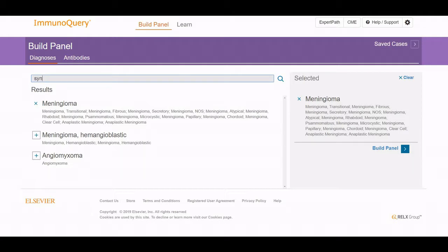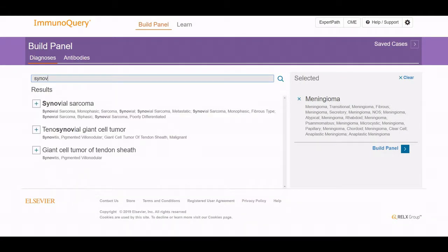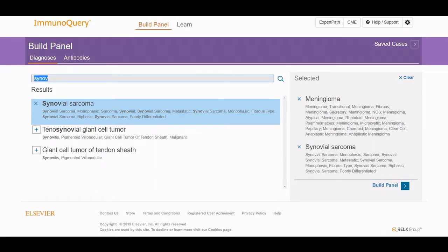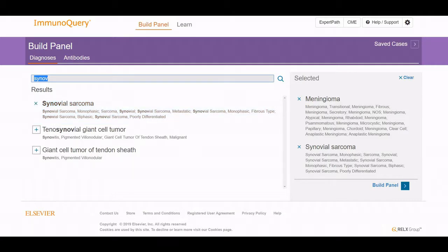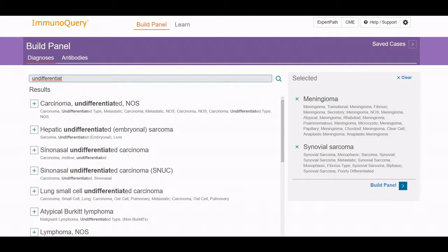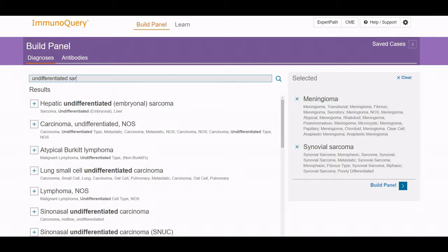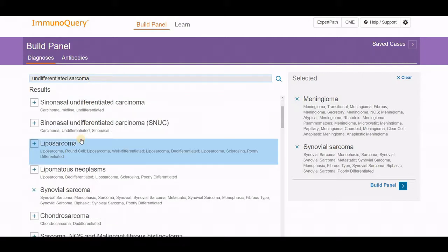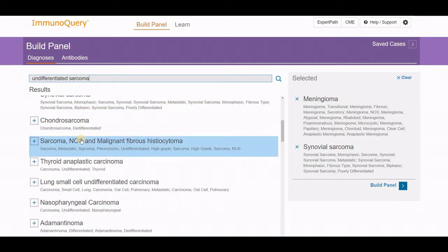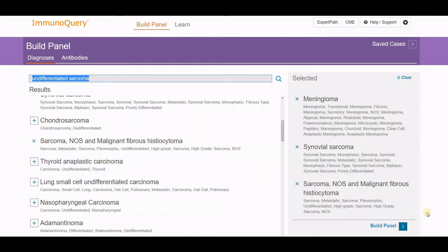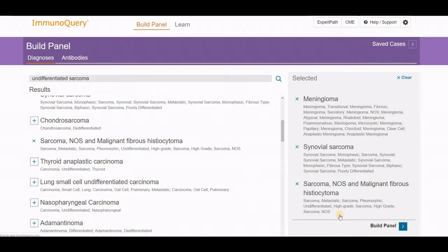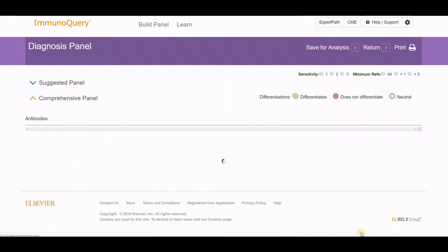The second alternative was synovial sarcoma. This is a very unusual nested and spindle cell tumor of the sinonasal tract area, with areas that had either synovial sarcoma or meningioma-type patterns. But there were also areas with a more undifferentiated carcinoma or undifferentiated sarcoma appearance. If you type out undifferentiated and scroll down, you should be able to find your particular result. Here you can see sarcoma NOS and malignant fibrous histiocytoma. When you get to this side, build panel is now available, and you just click on that function.